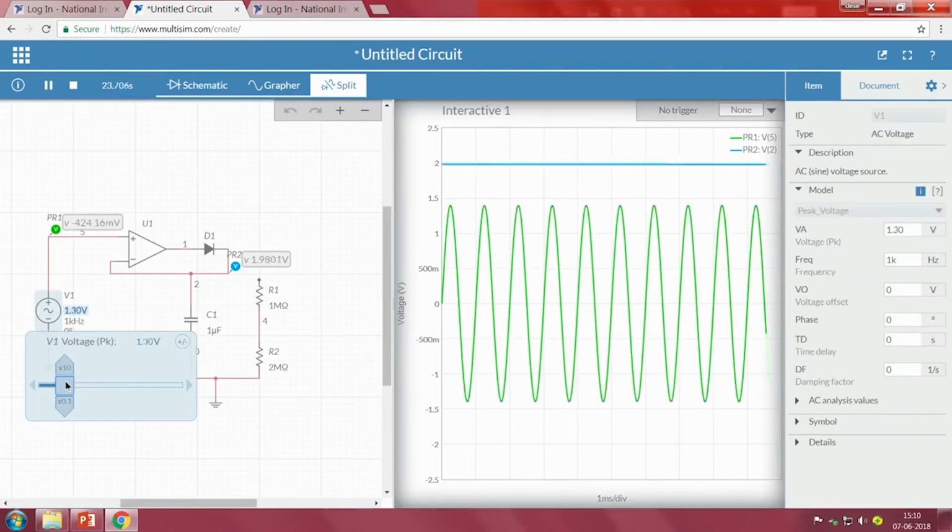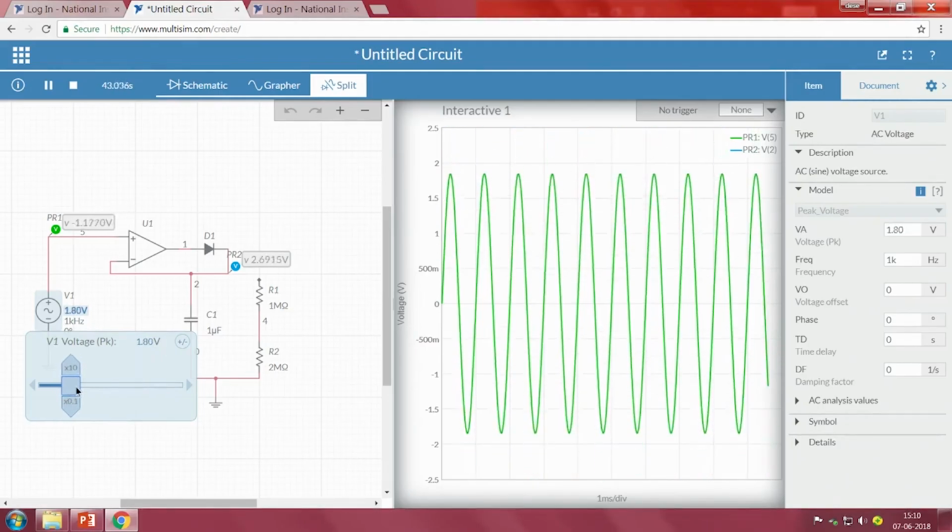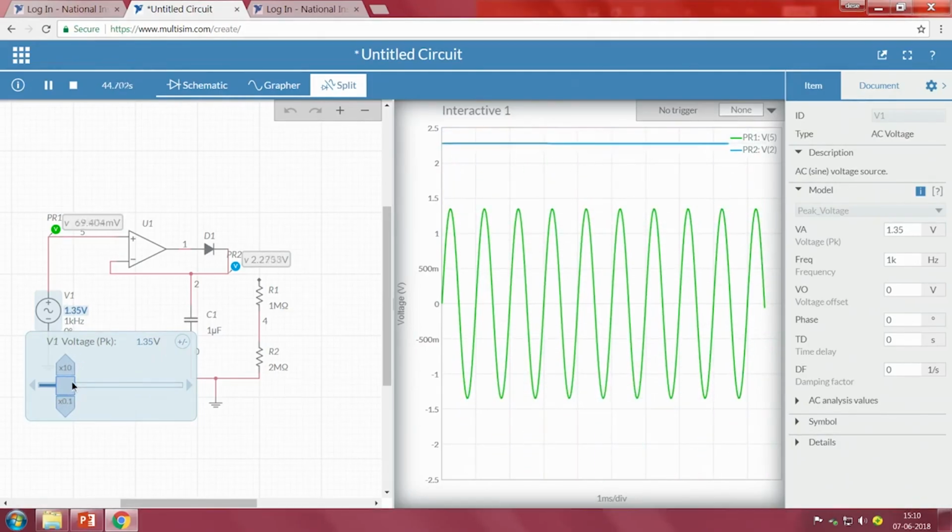Now, what if I decrease? Let me decrease. Now, the capacitor started slowly decreasing, because the input voltage now is much smaller, and the capacitor will also take some time to discharge, because that entirely depends upon the discharging rate. So, it started discharging, and again continuously maintains the value of the peak. So, that means one part is clear: whatever the peak voltage that we are getting, the capacitor will charge to that peak value.